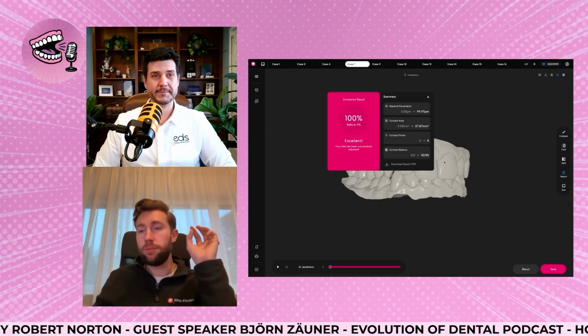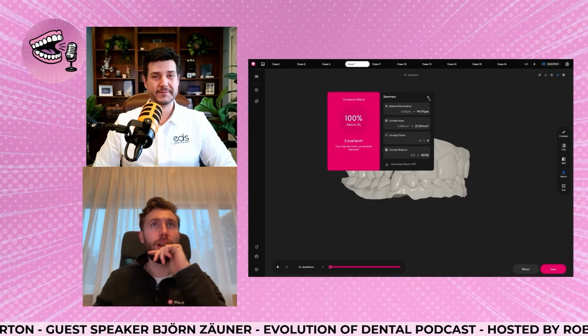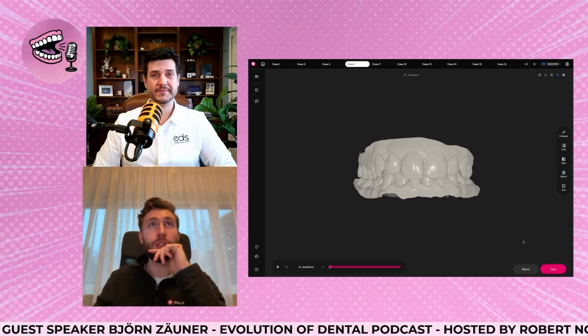Then the report, of course, similar to before, we have some values, different styling. We can also customize it, put the lab logo on top of it. They can share it with the dentist. So all these sweet little quality of life improvements, which are nice.